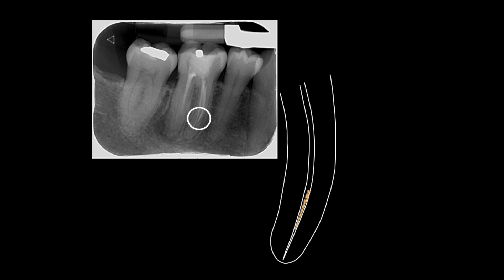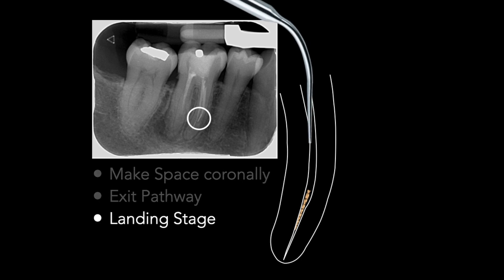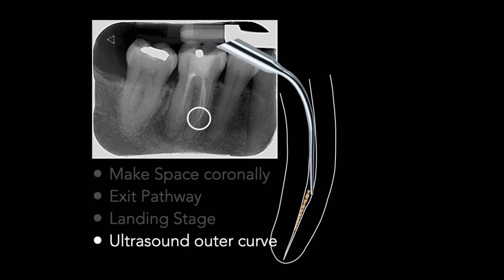To remove pieces of fractured instrument from deep within the root canal system, you need to make sure there is enough space coronally for the piece to be retrieved. In this case, I created a landing stage using the Wave 1 Gold primary instrument. A fine ultrasonic tip needs to be applied to the lateral aspect of the piece of file to vibrate it so that it can be loosened.